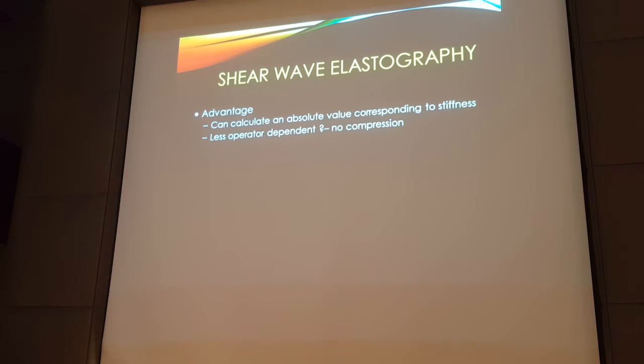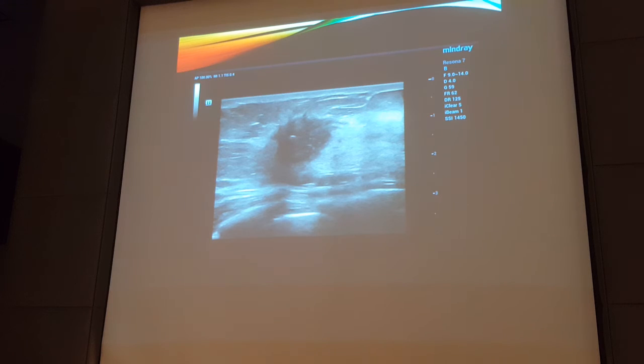People say that there's an advantage to 2D shear wave because it's less operator dependent. I think that's probably true with the systems that, for strain, you have to apply pressure and learn where that sweet spot is. But again, on the Mindray system, you really don't have to move the transducer. You just lift up the transducer and the patient's breathing will give you the result. So the learning curve is actually quite low. And in both shear wave and strain, the biggest problem is pre-compression. I think people don't realize how hard they're pushing with the transducer.